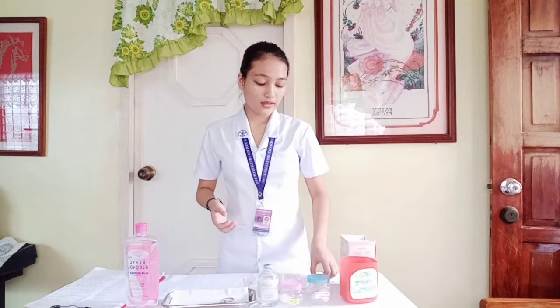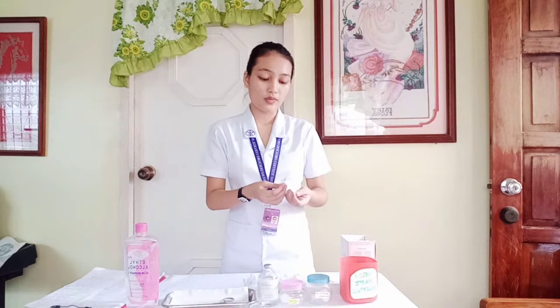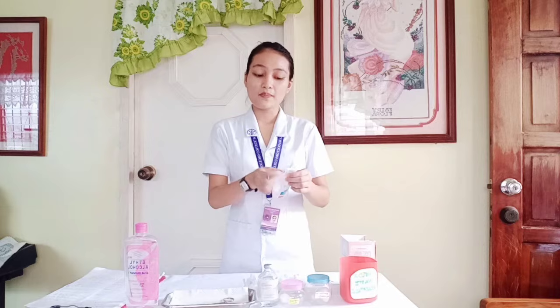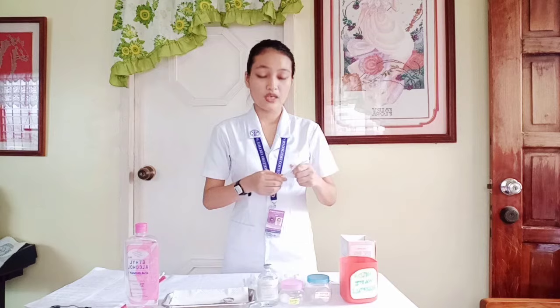So, to prepare the medication in an intradermal injection, first we need to get the tuberculin syringe and open the sterile package. Always remember that we can only touch the barrel and the plunger of the syringe to avoid contaminating the needle. If the syringe is capped, then remove the cap first, because we'll have to connect the tuberculin syringe to the aspirating needle.